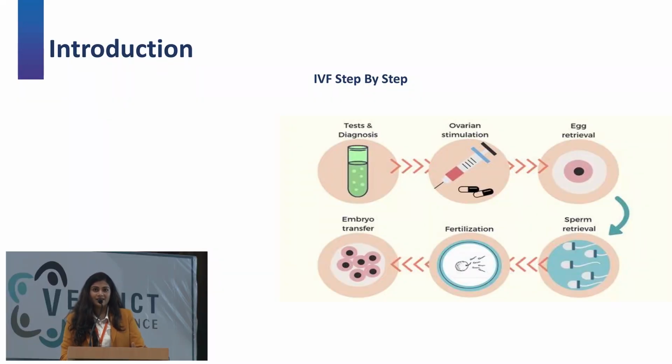Once the patient has been recruited, the stimulation begins. Then when the trigger is given, we count it as day -2 because the day of pickup is known as day 0. So we'll start from preparation that starts on day -1.